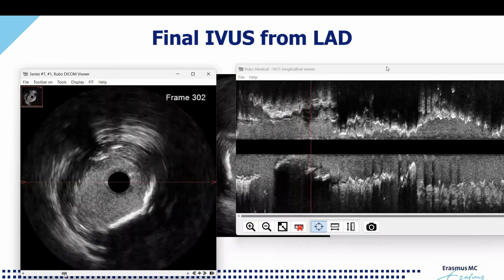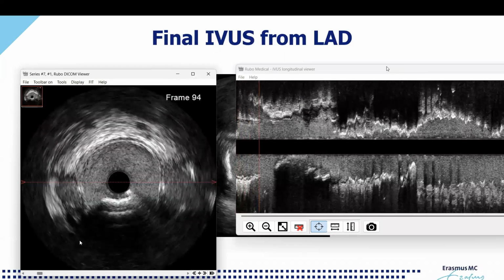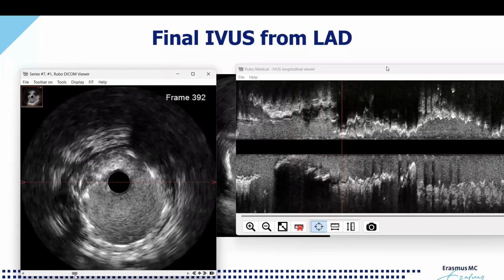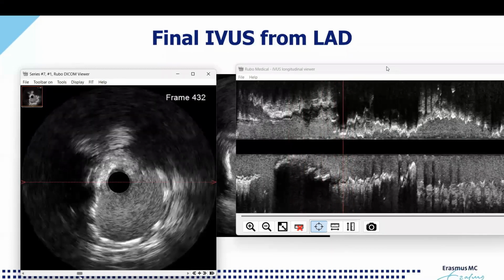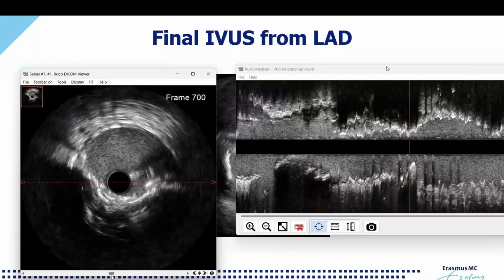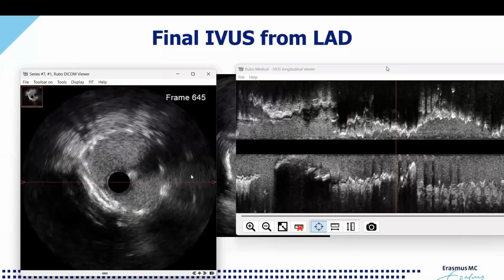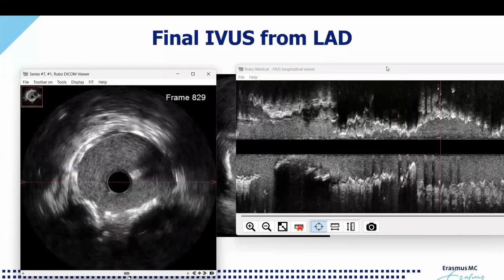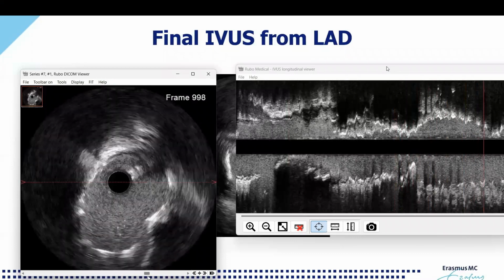So we start now more proximal in the LAD. We see then the diagonal branch and a septal branch coming in from both sides. There is a stent, and you see the oval-shaped stent due to the eccentric calcium. Then here we have the circumflex. The stent is, in this case, jailing the circumflex, and you can appreciate that the wire comes in from 3 o'clock. But what you can appreciate, and I think this is critical, is that the circumflex is a huge branch, right, Jurgen? Absolutely.